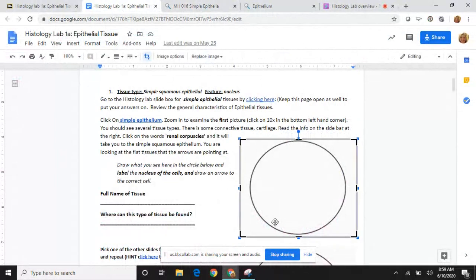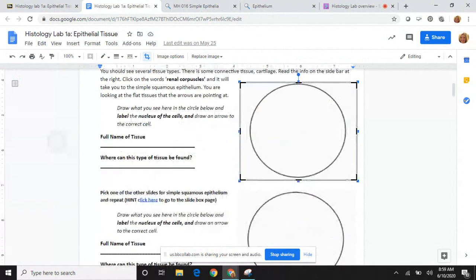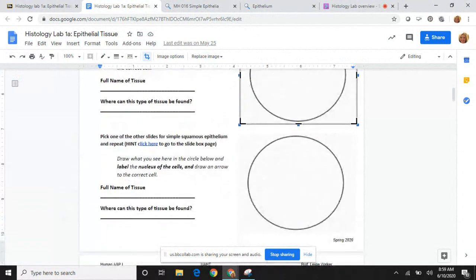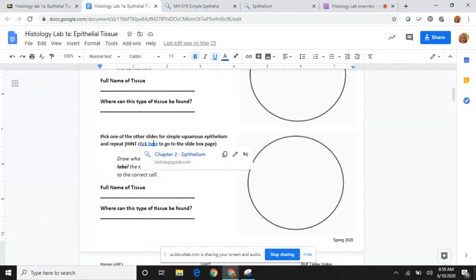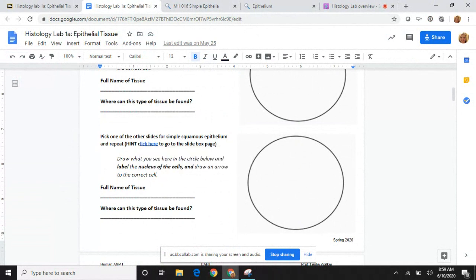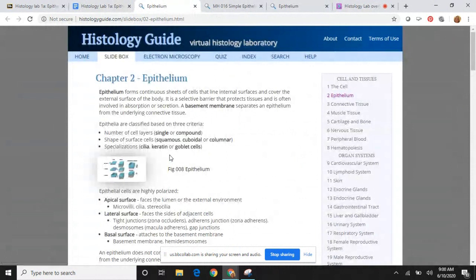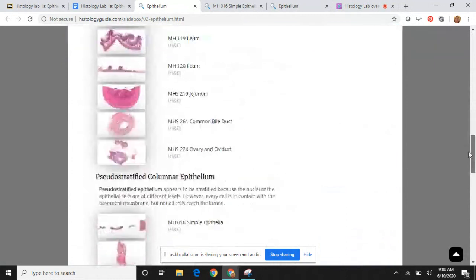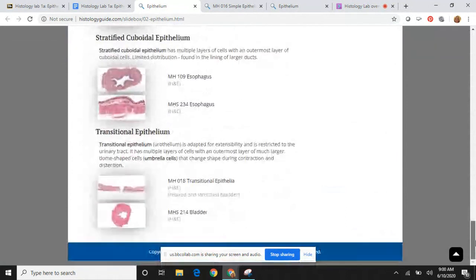What you're going to do then is draw that view in the box on your worksheet. You're going to draw the features I talk to you about, and then there are some questions for you to answer. You go along and follow more directions — I give you direct links to where I tell you to go, like picking another slide for simple squamous epithelium and trying it again. I also tell you to do some quizzes, which are not for credit but are really for your benefit. You really need to do these.